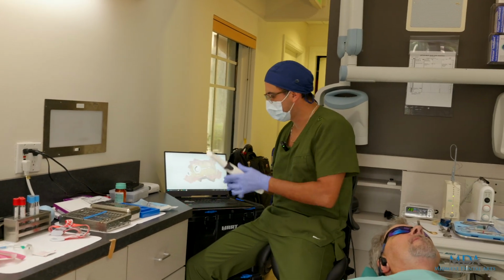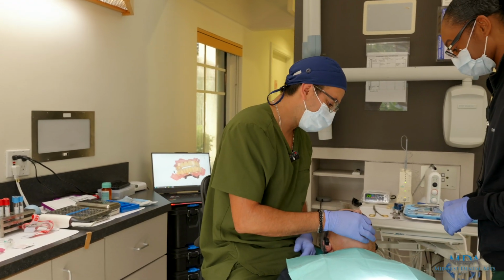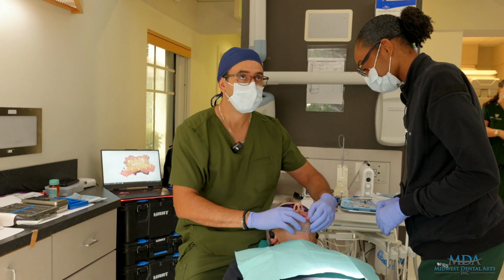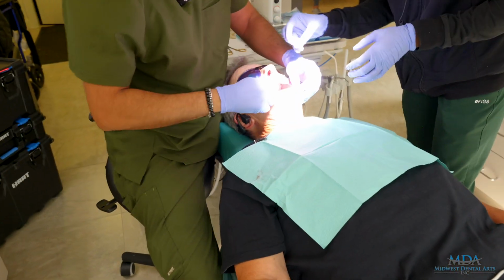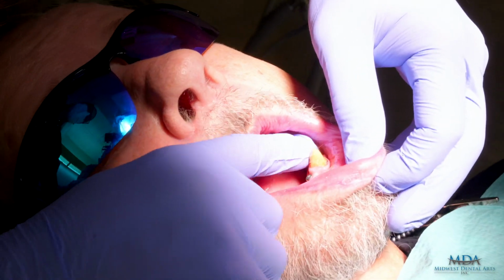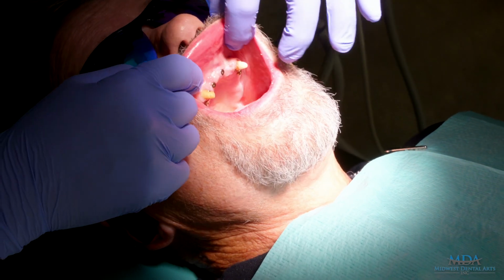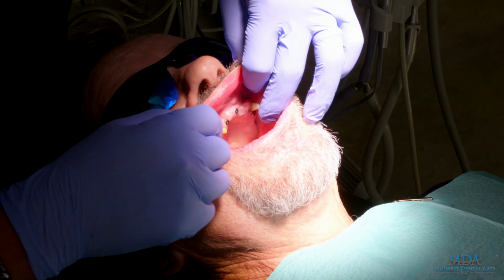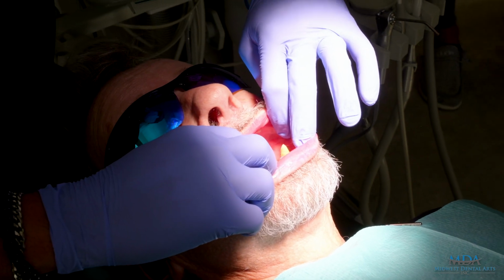So now the fun part starts. The first thing we're gonna do is switch out the multi-unit abutments right here. We already have all the x-rays and initial scans. These are the teeth. The implants are already placed. So we're gonna switch out these healing caps for our multi-unit abutments. They're gonna be a pathway to anchor our hybrid here on the upper and the lower. So let's do that.